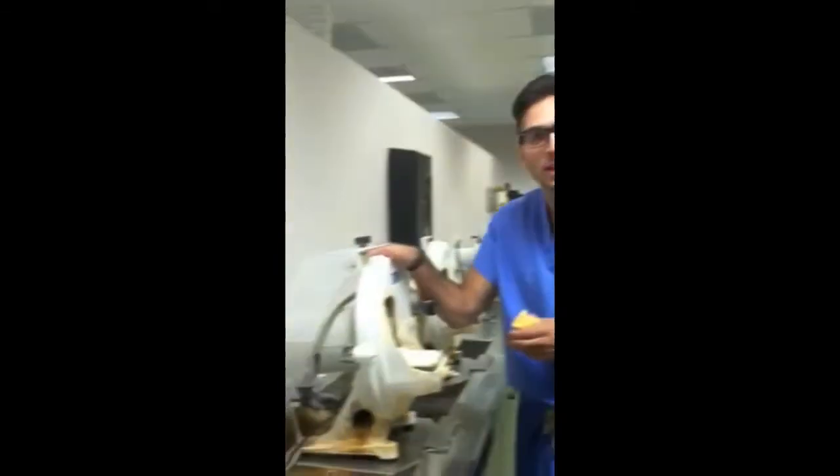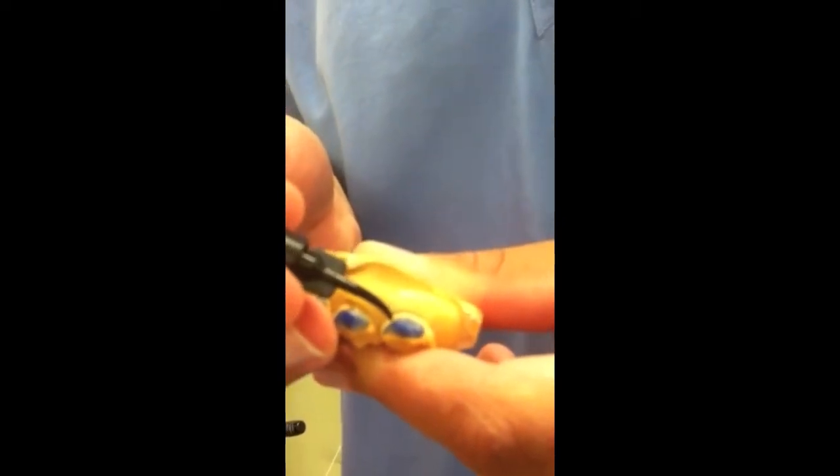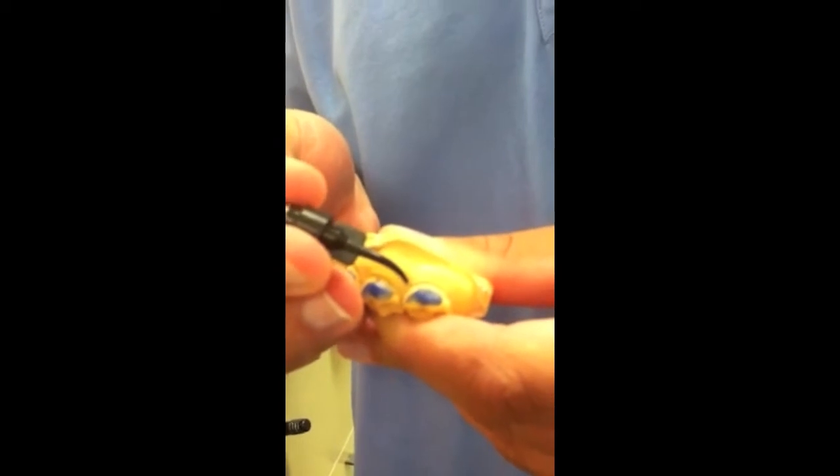We also want to make sure that the occlusal plane is parallel to the base of the cast. To accomplish this, we'll be using this nice machine right here. And this is what it should look like when you're done. After you've trimmed your cast, you want to apply block-out resin to every single tooth in the arch, making sure you're a millimeter away from the incisal edge and the gingival edge to prevent translucency in the incisal and gingival irritation. Make sure the thickness is about 0.5 to a millimeter thick, allowing for the resin to set on the tooth structure.